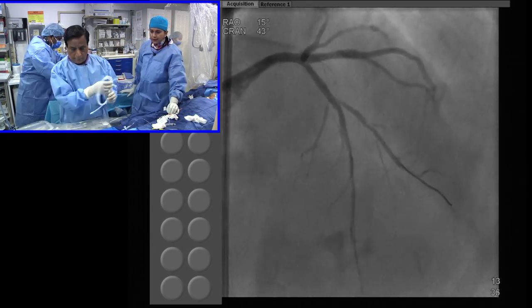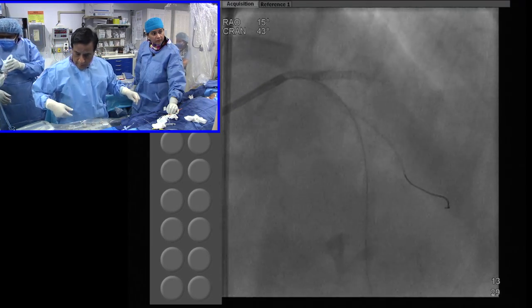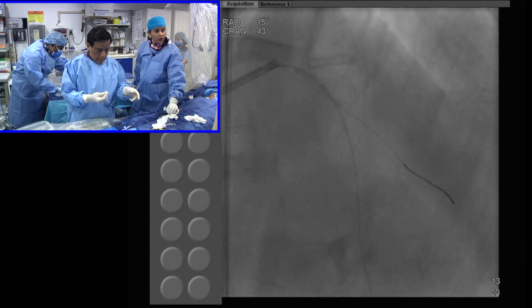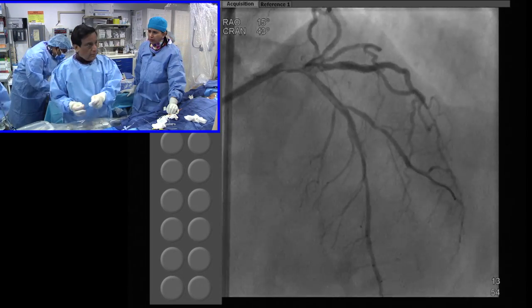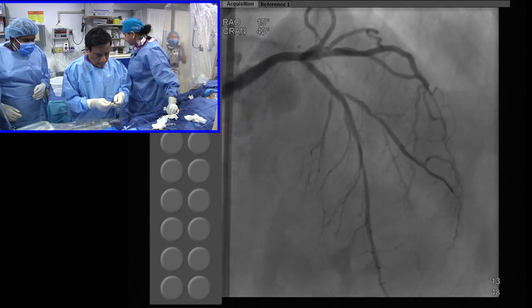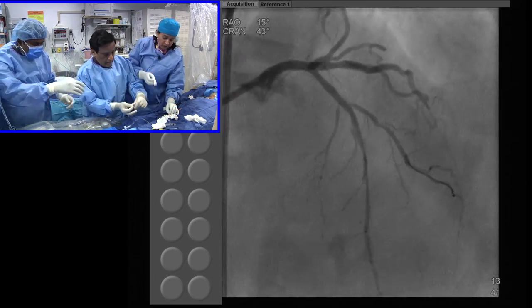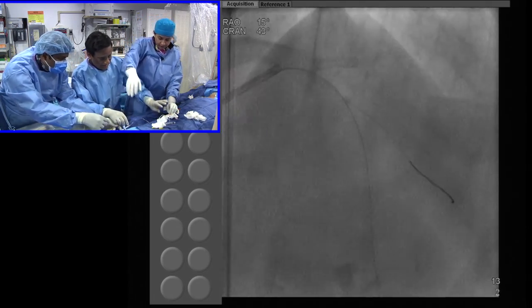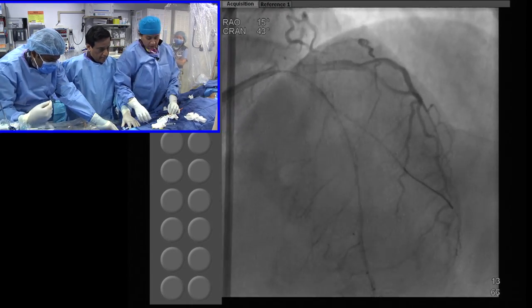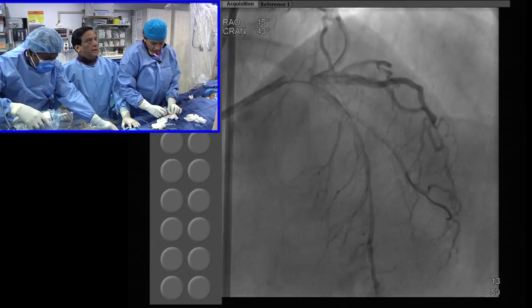It's a very small vessel. So Anu, angiographically, what would be your prediction of the size here? 3.0? I don't know, they come in 2.75? No, too big. You want to put a 3? Okay, so let's see what OCT shows us. OCT will show you 2.2. Go. 3.0 proximal, it's too big. They come in 2.75 or no?